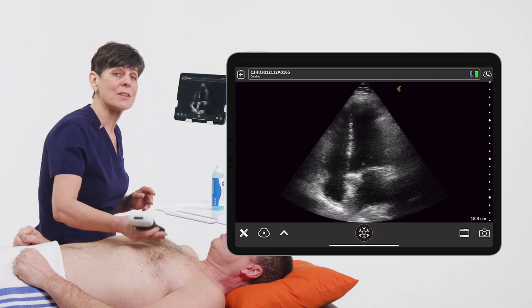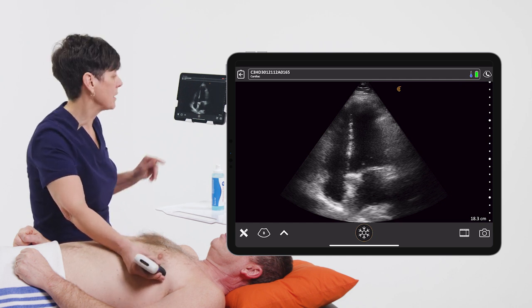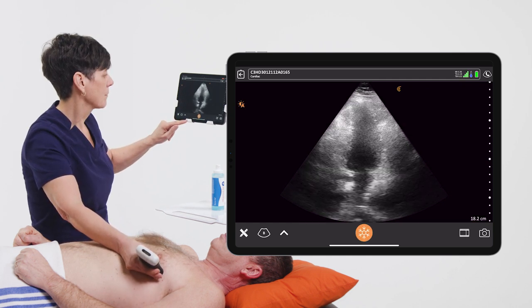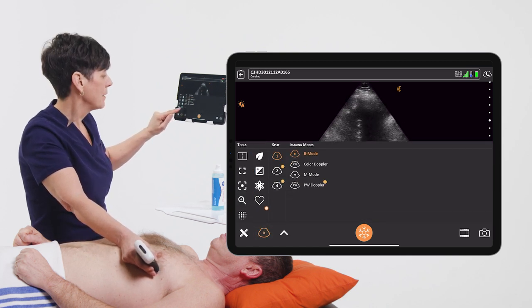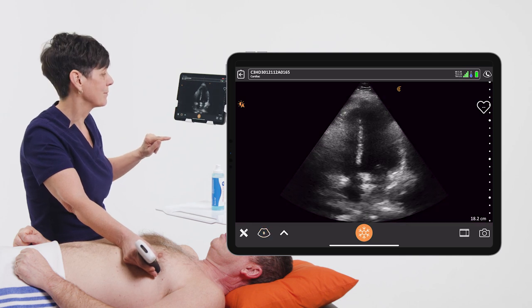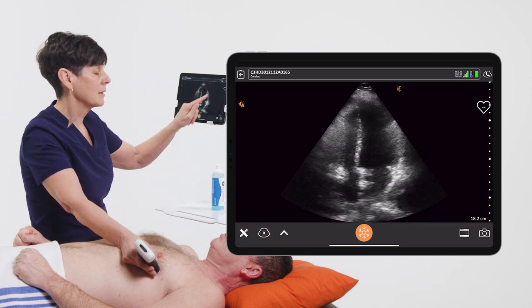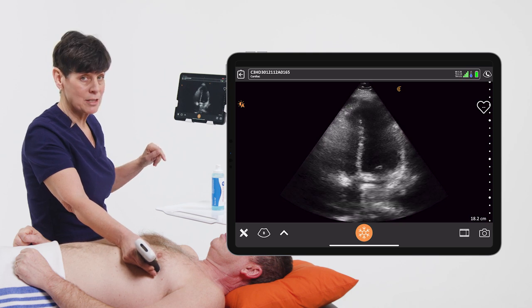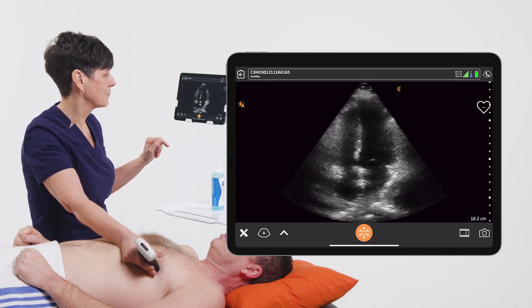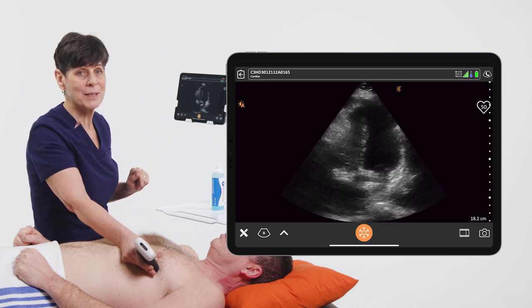So with a real-time image of the heart from any window on the screen, you simply go into the Modes menu and tap on the little heart. You'll see the little heart appear in the upper right-hand corner, and after just a few cardiac cycles, you'll see the heart rate information displayed.